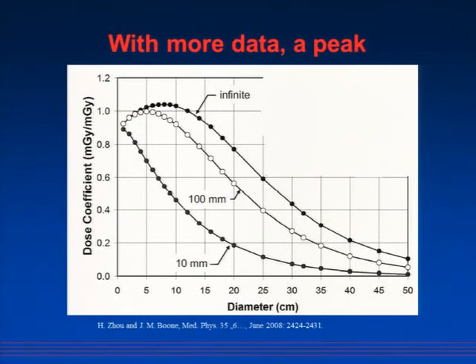And what we've seen in some of our different phantoms is that the peak dose does not occur at the center, nor does it occur at the very edge. It may occur somewhere a little bit away from the edge.